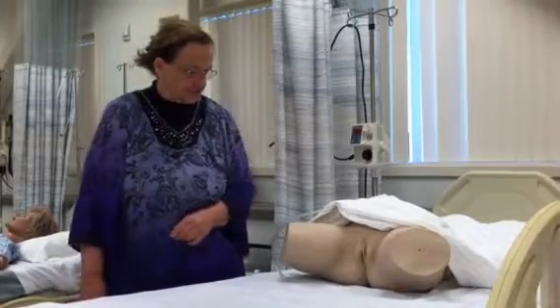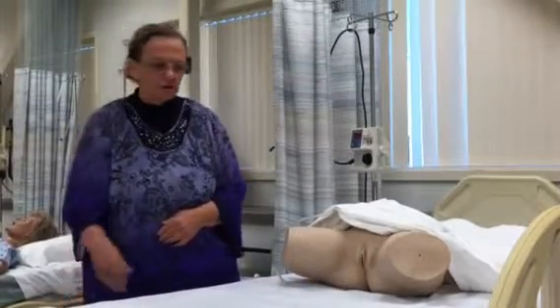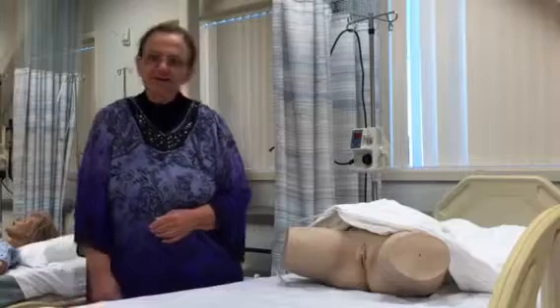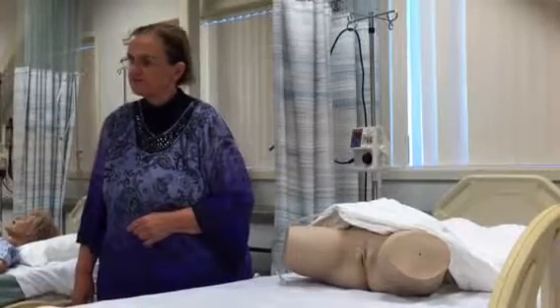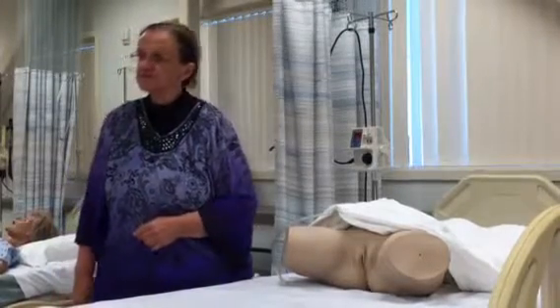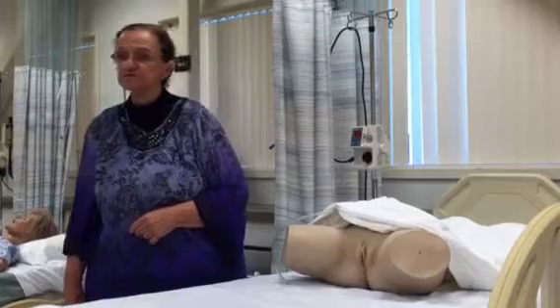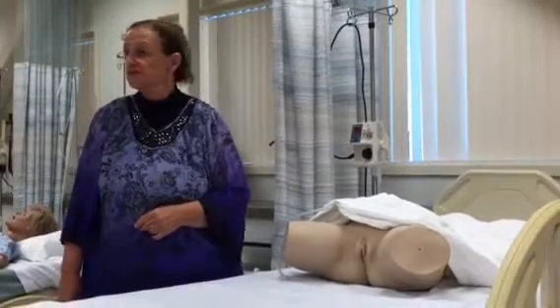Whenever you get an order for a urinary catheter for a patient, just remember that urinary catheters are the single most significant source of hospital-related sepsis, and as a result, you want to be absolutely sure that you're putting this in under sterile procedure, because we don't want to introduce bacteria into the bladder, which will then go to the ureters and the kidney and the blood.